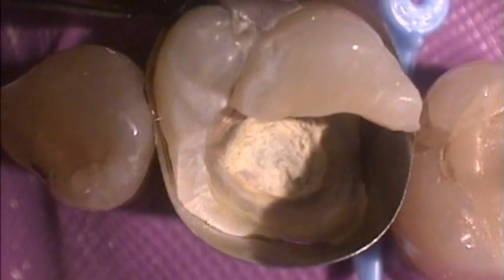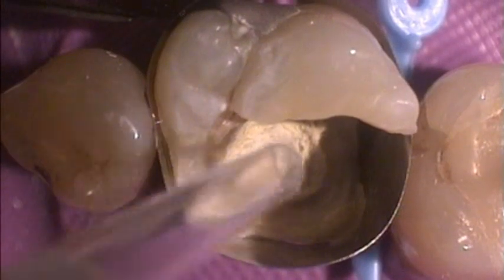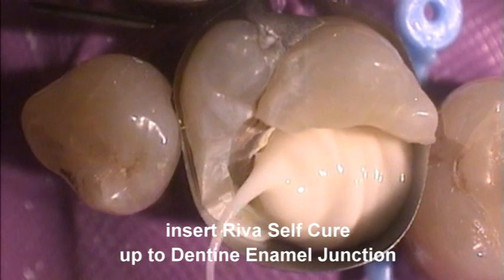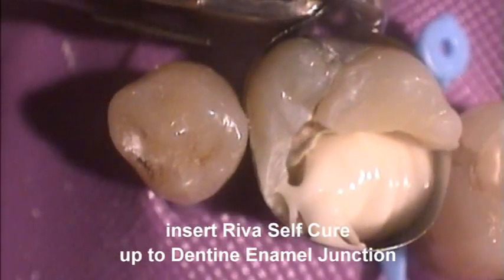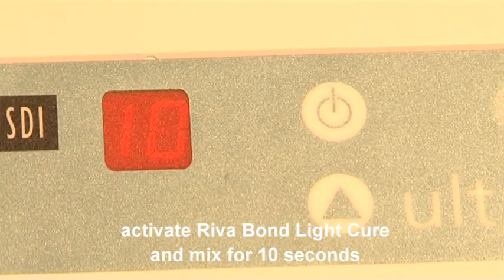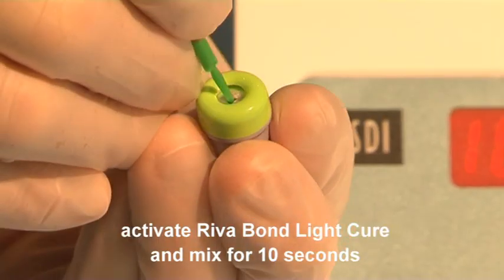Place a suitable matrix system prior to restoration placement. Insert Reva SC or Reva SC-HV into the preparation up to the level of the dentine enamel junction. Prepare a resin modified GIC bonding agent, Reva Bond LC.